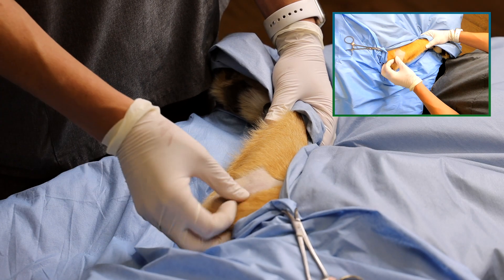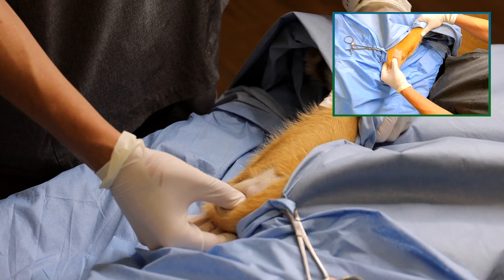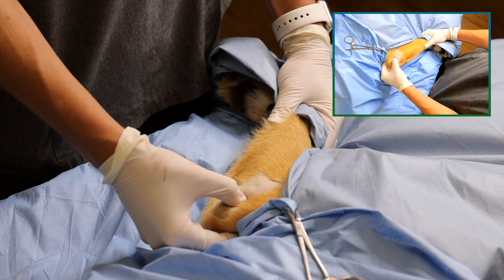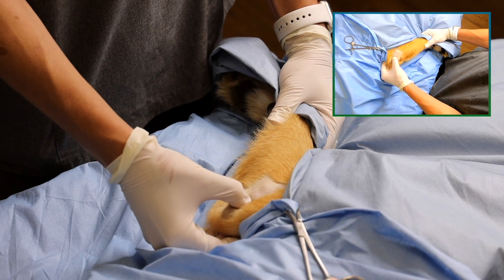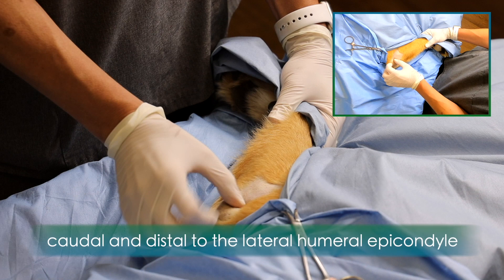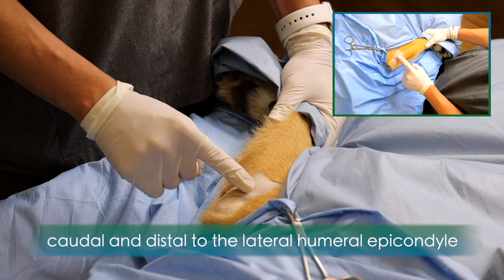To inject the elbow from the caudolateral approach, the patient will lay in lateral recumbency with the affected elbow accessible. The joint should be clipped and aseptically prepared for joint injection, caudal and distal to the lateral humeral epicondyle.